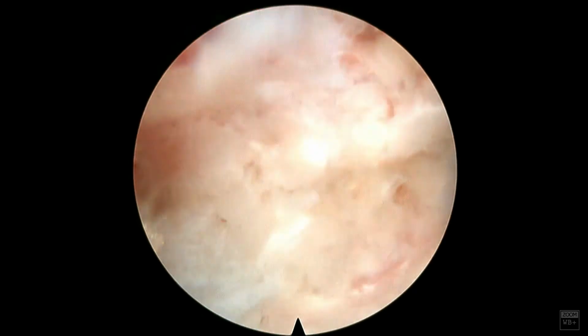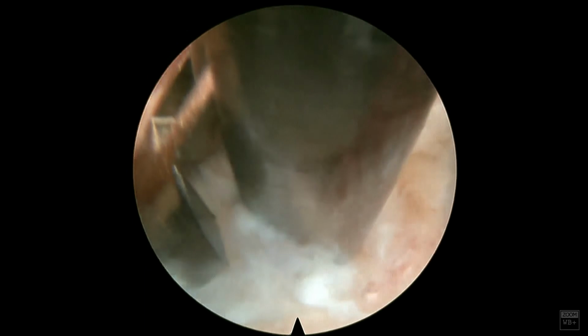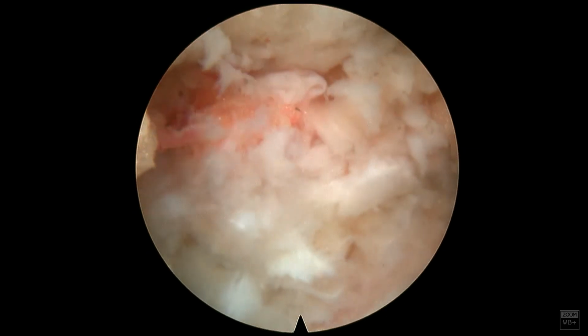So this time I'm using my pituitary to remove some of the calcified disc and some of just the chalky annulus fibers. I'm not going to spend too much time doing this because again, that's not really the main culprit of my compression.